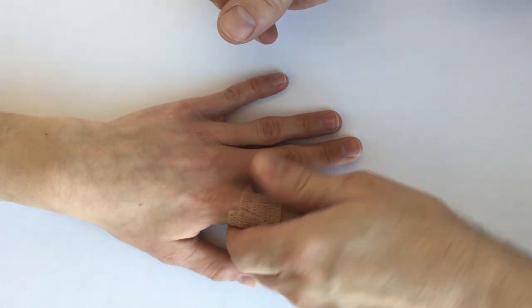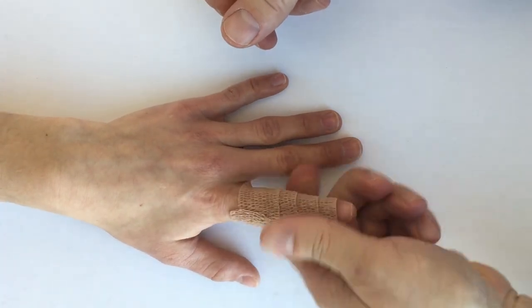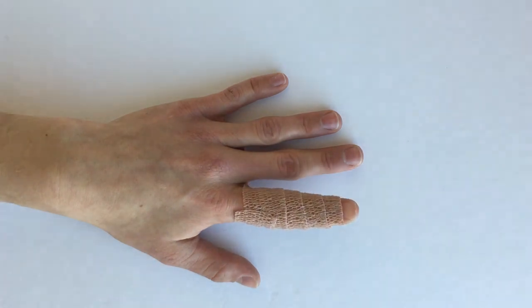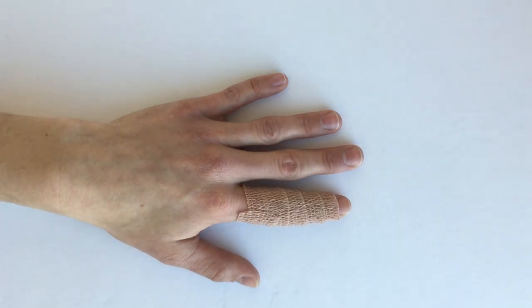Once you have the whole finger wrapped, you can compress it down a little bit to get it to stick to itself, and that is how you would use Coban for an edematous finger.